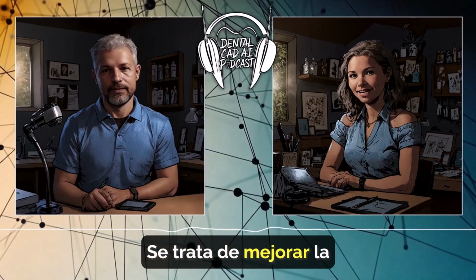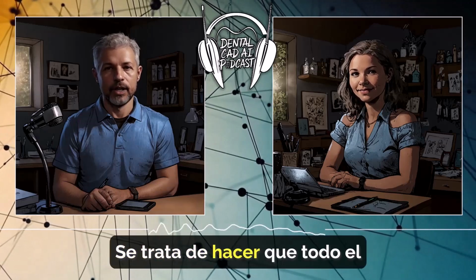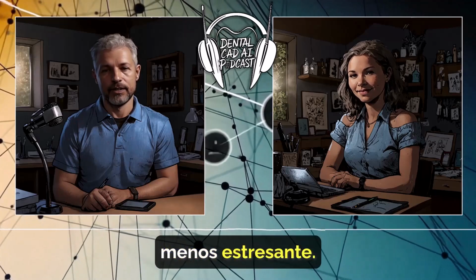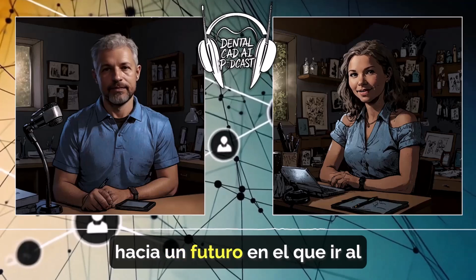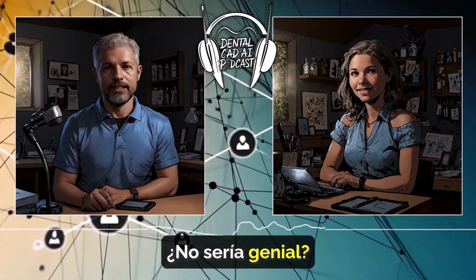It's all about making the experience better for the patient. Exactly. It's about making the whole process smoother, more efficient, and ultimately less stressful. So you're saying we're moving towards a future where going to the dentist might actually be enjoyable. Wouldn't that be something?